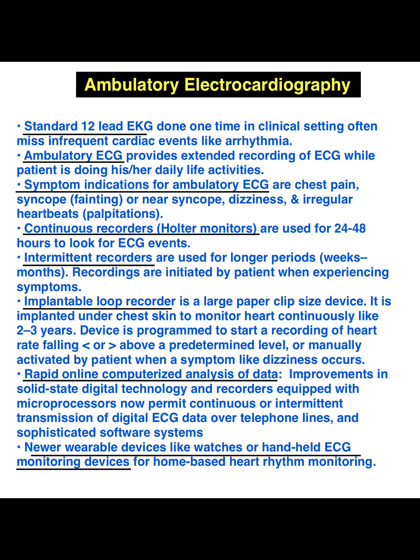Ambulatory ECG provides extended recording of ECG while the patient is doing his or her daily life activities. Symptom indications for ambulatory ECG are chest pain, syncope or fainting or near syncope, dizziness, and irregular heartbeat or palpitation.